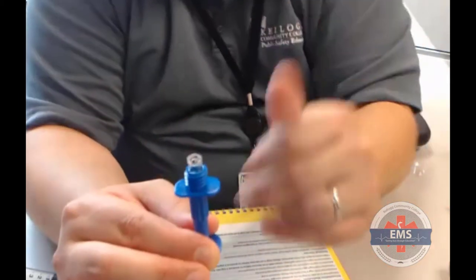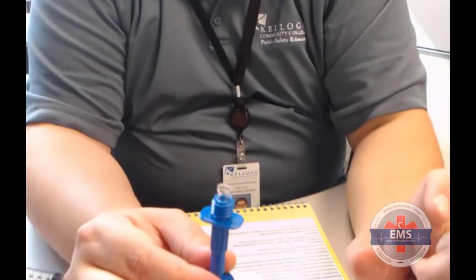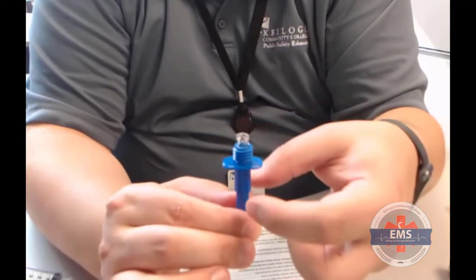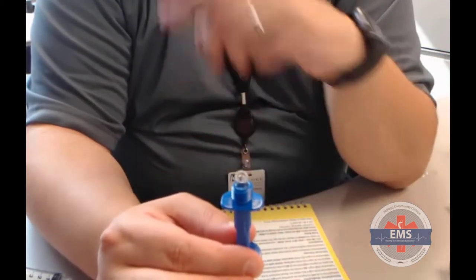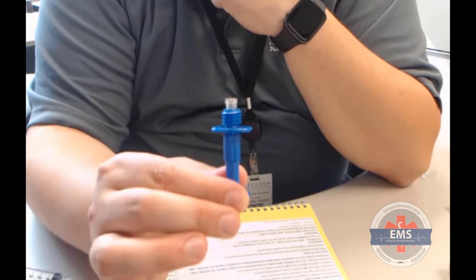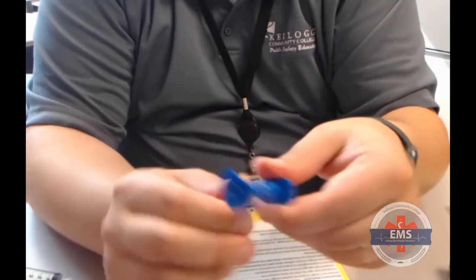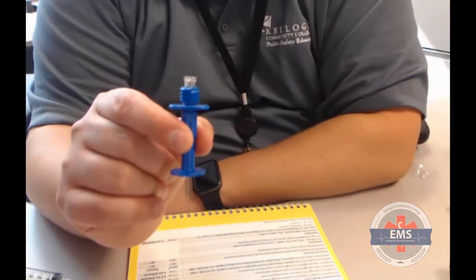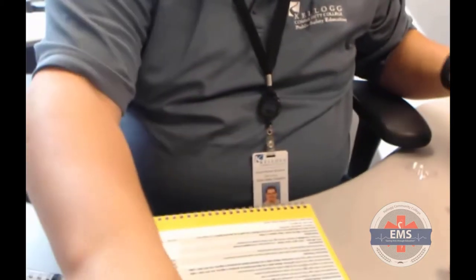Once this is in and my line is attached, now I need to use 2 bulky dressings. I typically like to use some 1 and 2 inch rolled gauze. I just take it out of the package, keep it all rolled up, and stack it on this side, stack it on that side, so I end up creating a little bit of Lincoln logs here. Then I can tape that right down to my patient's leg, and it does a nice job of securing the actual I/O in place. Very important that we try not to move this around because it will move around, and it also sits up really tall, much taller than you would see with the actual Easy I/O, pardon me.